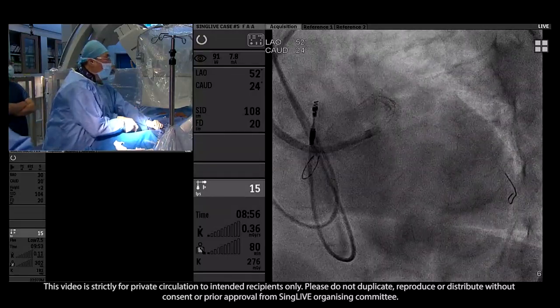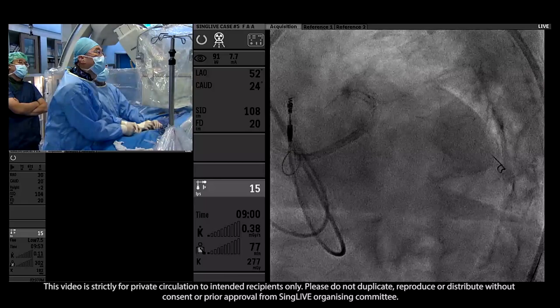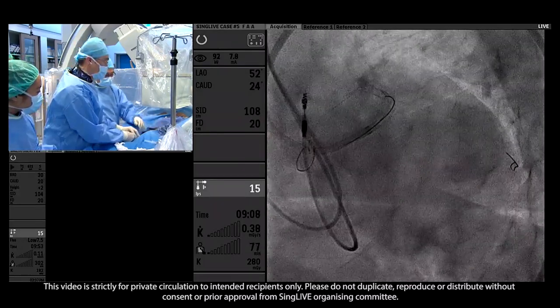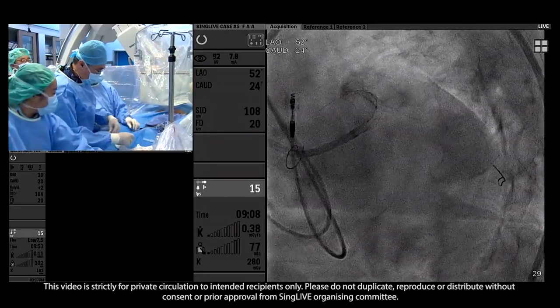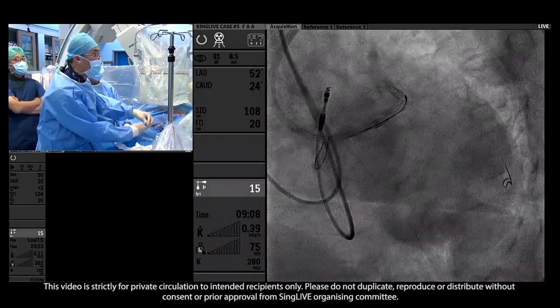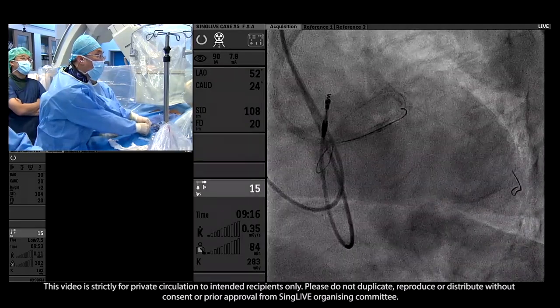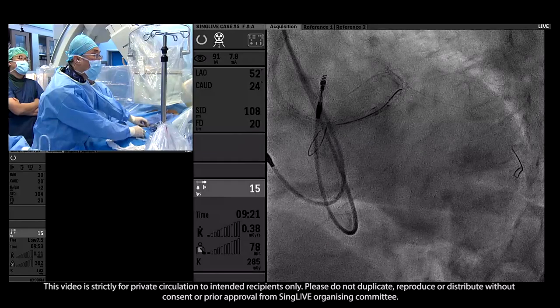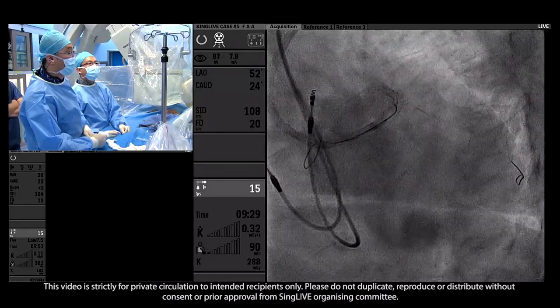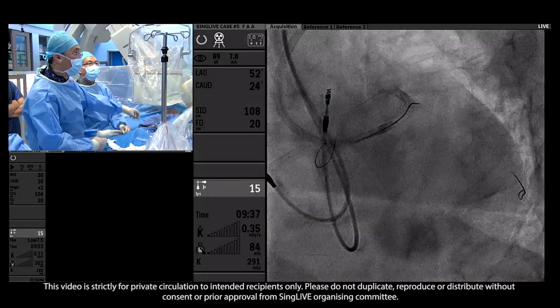Again, we're taking the Crusade dual lumen catheter to try to assist us in rewiring. We're taking the third wire. I think it should be okay. There were difficulties wiring before the stent. Now with the stent, the difficulties are even more. So I would have dilated a bit more for the circumflex. Now, if we can't cross with the wire, maybe we can just do it with a provisional without kissing. But I think with the dual lumen catheters, it does make it easier to do this rewiring.